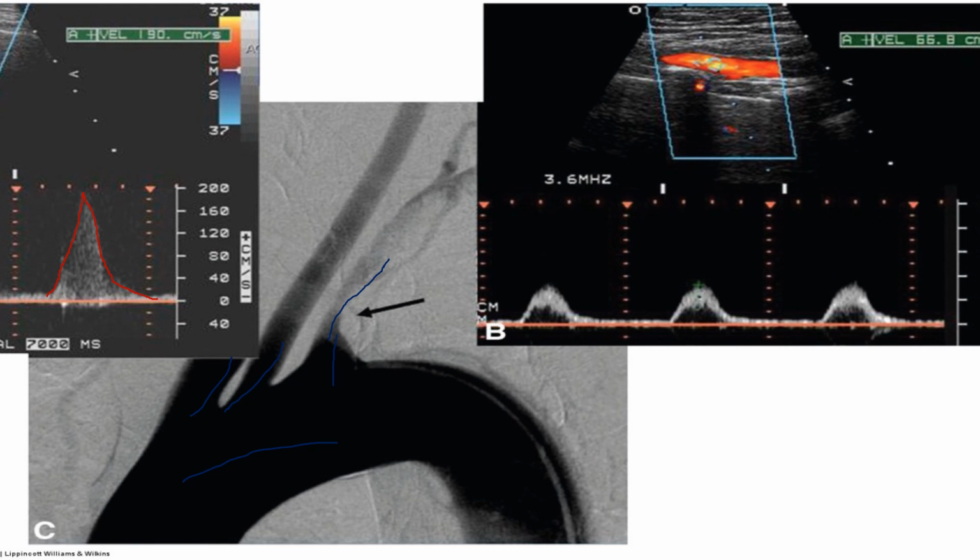As it goes through this particular stenosis, you would expect it to return to some of that more normal waveform, but you would also expect to see a much higher than expected peak systolic velocity here. Distal to that, in this region, you might see something that looks like this. You can see that the volume of blood flow in this region is now decreased, so there's really no resistance, because the volume is so low, and blood just flows forward in a very low resistance pattern.